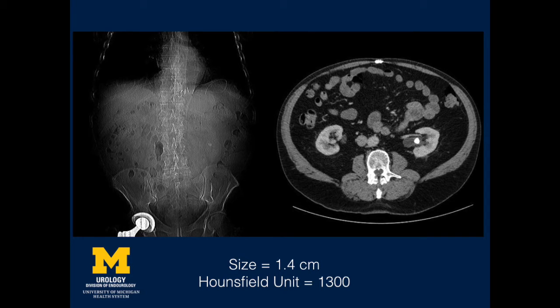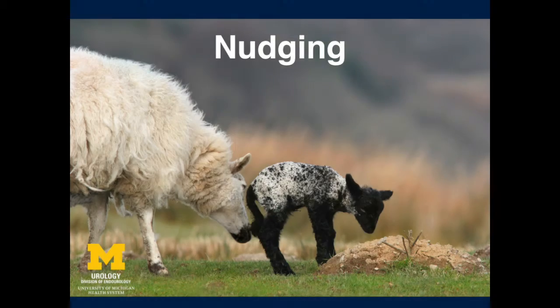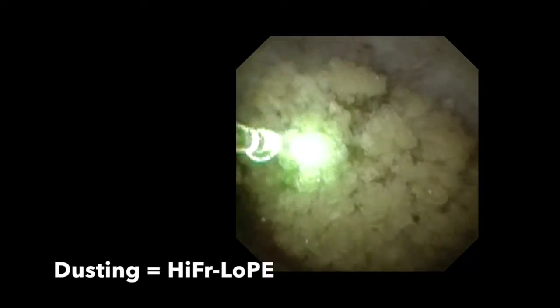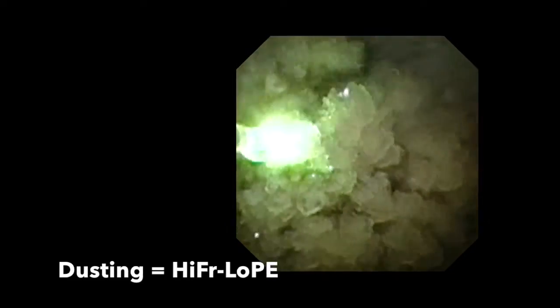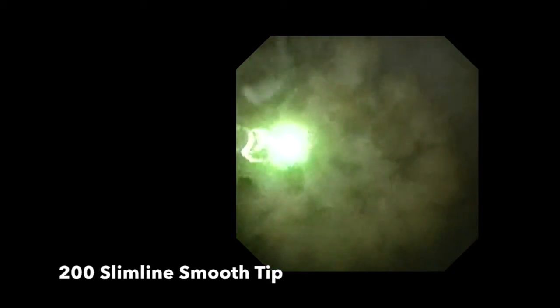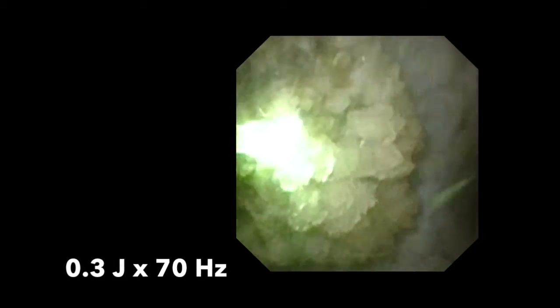The first case is a patient with a 1.4cm renal pelvic stone with a Hounsfield unit of 1300. We begin by nudging the stone with the flexible uroscope into an upper-pole location. We begin dusting technique using a 200 slim-lined, smooth-tipped fibre at settings of 0.3 joules times 70 hertz using the P120 Holmium laser.